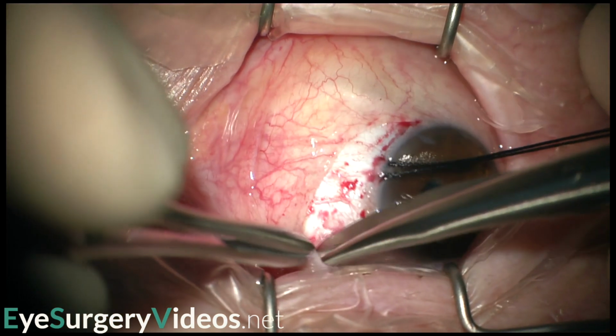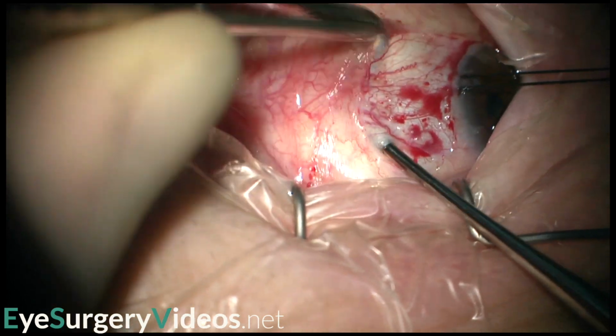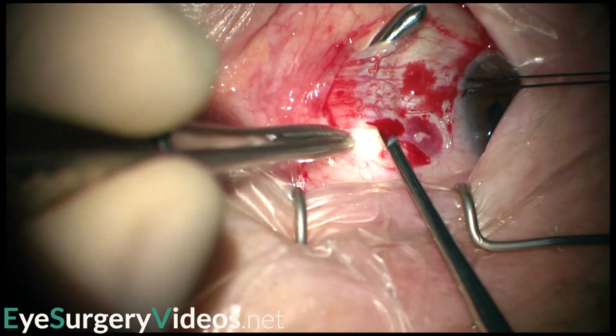The muscle is isolated and exposed as per any standard squint operation. Cautious diathermy is applied, though this generally should be avoided onto the muscle itself, as this may cause histopathological artifact.